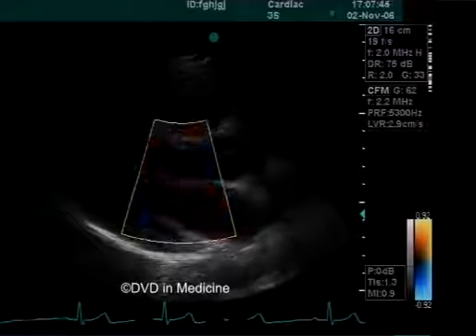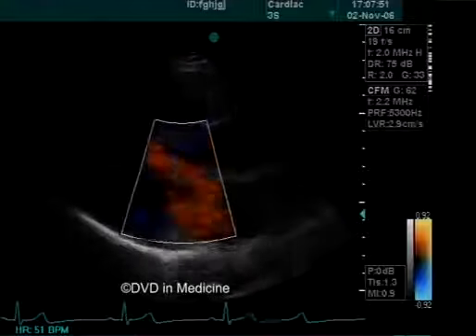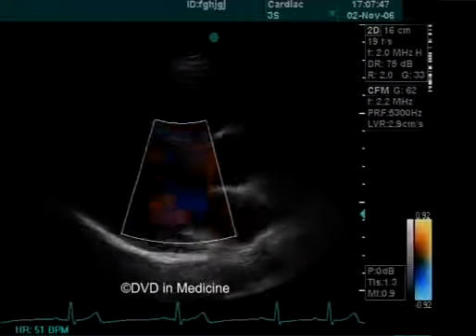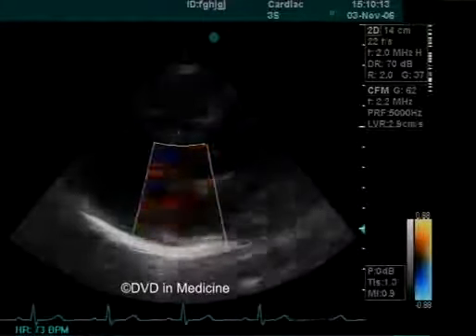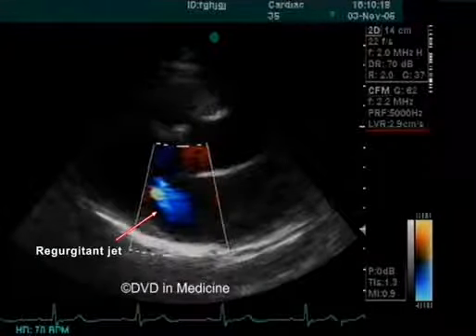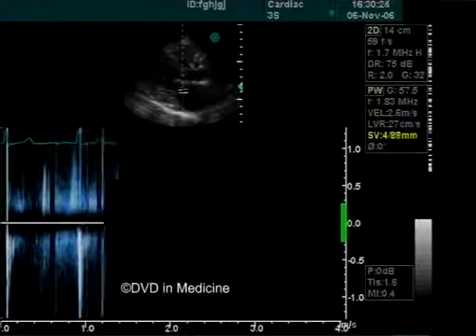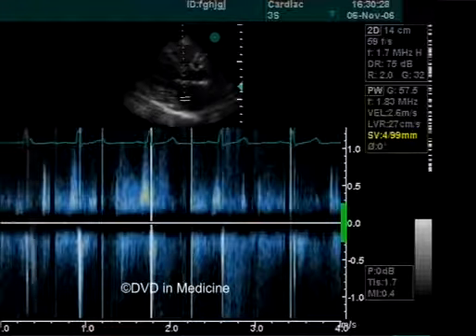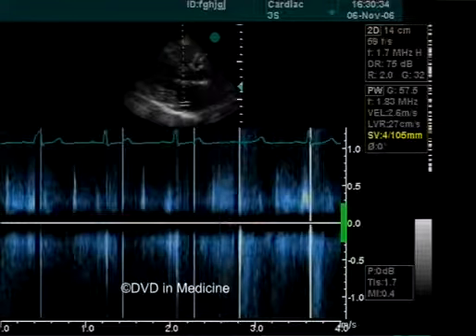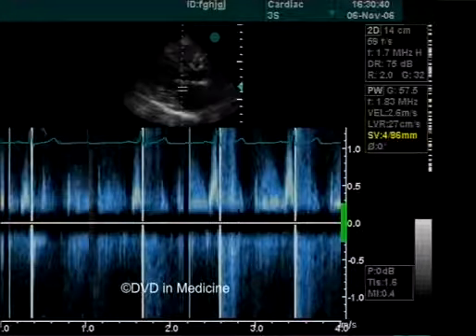If one sees only red and blue colors in the Doppler's color sector, this indicates that only normal laminar blood flow is present and that regurgitant jets, or high-velocity flows, through the stenosed valves are absent. Regurgitant jets, or turbulent high-velocity blood flows, will be represented by a green color or a bright mosaic of colors. With pulsed Doppler, one can evaluate zones either under or above the valves. In this case, one should shift the sample volume to the zones of interest.